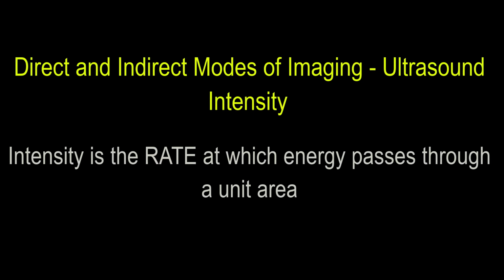So now we'll be discussing the direct and indirect modes of imaging and how they impact ultrasound intensity. But let's first define what intensity is. Intensity is defined as the rate at which ultrasonic energy passes through a unit area, and in this context, we'll discuss all the direct and indirect factors that affect ultrasound intensity during imaging.